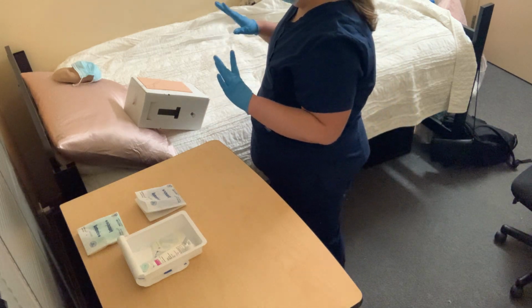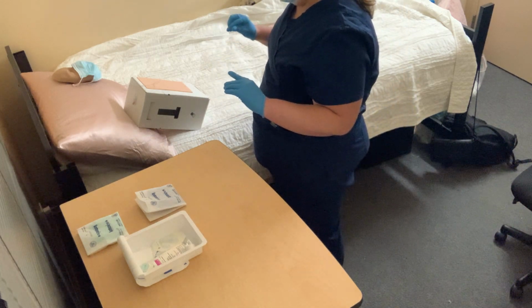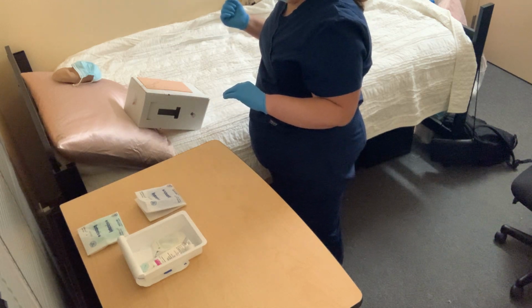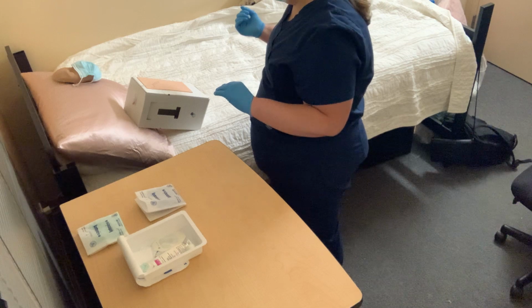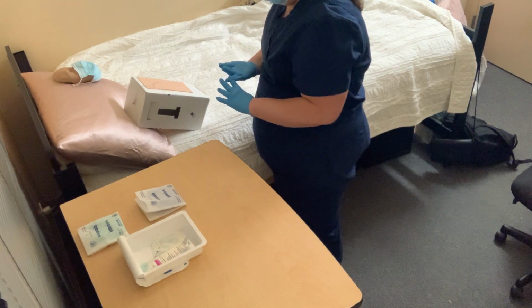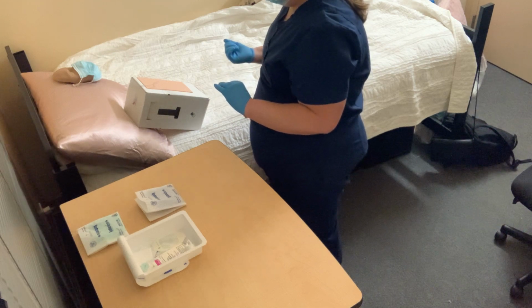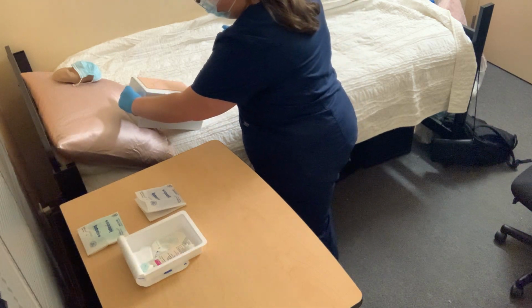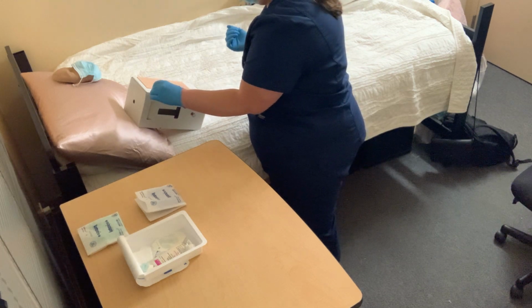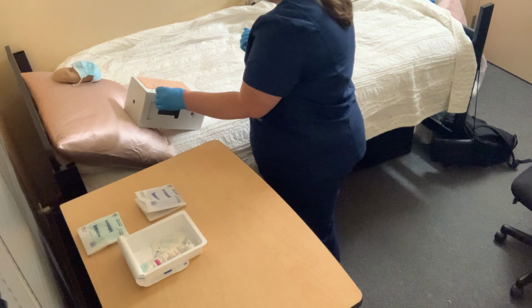Now that the site is exposed, I'm going to go ahead and do an assessment. So first I'm going to check for any signs of infection. I don't see any redness, no swelling, no drainage, and no bleeding. So there's no signs of infection. I'm also going to assess the tubing to make sure that there's no damage to it, no leakage or breaking, which I do not see any of the above, so the tubing's all right.